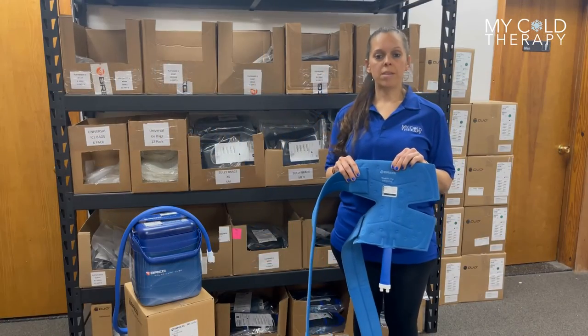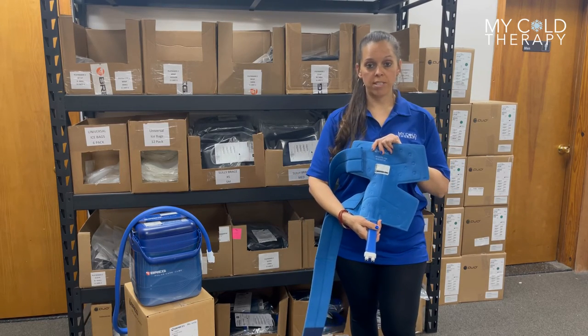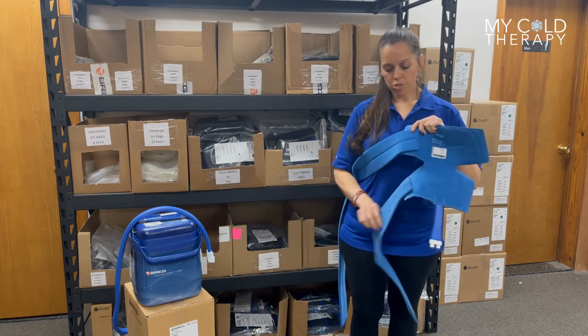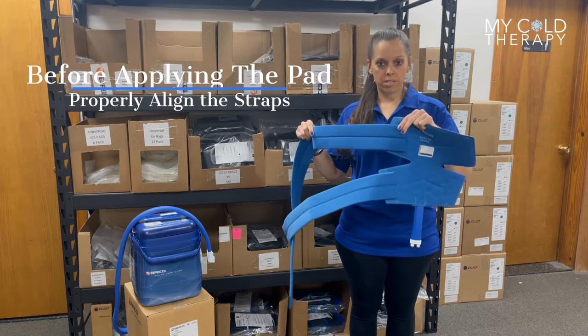To apply the Breg PolarCare Cube Hip Pad, before you start, always make sure your hose is facing downward. The pad itself comes with two straps — the shorter strap is going to attach at the bottom of the pad, and the longer strap attaches at the top.